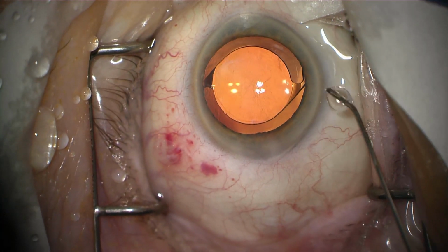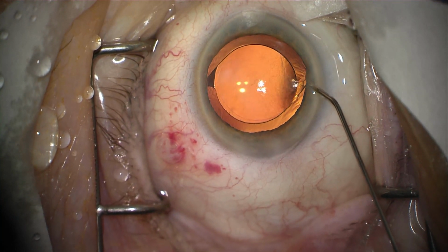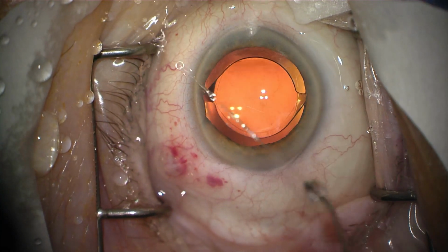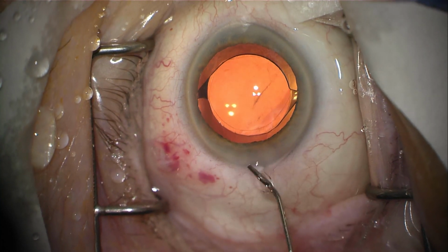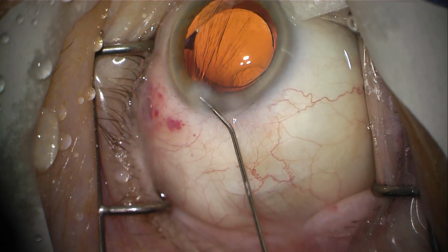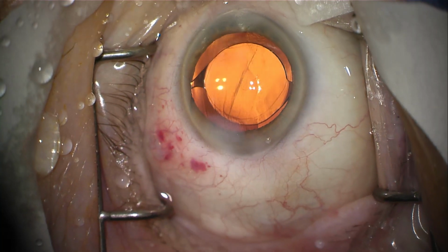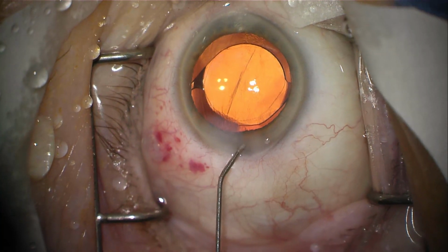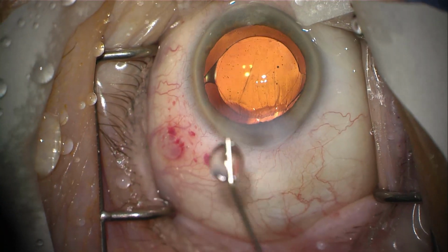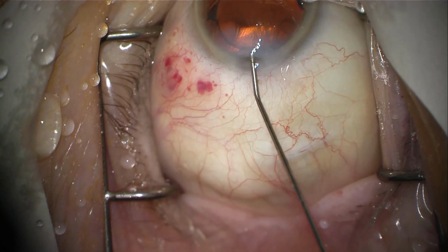Next thing I do is I inflate the eye with saline solution, which is similar to the liquid that's inside the eye. I'm squirting that in through the original tiny incisions that I made with the 1 millimeter blade. What I'm doing now is hydrating the cornea where I made my initial incision. I'm squirting saline solution into what's called a corneal stroma. The cornea is like a sponge. It absorbs this fluid. It turns white as it absorbs the fluid. What's happening is the cornea is swelling.